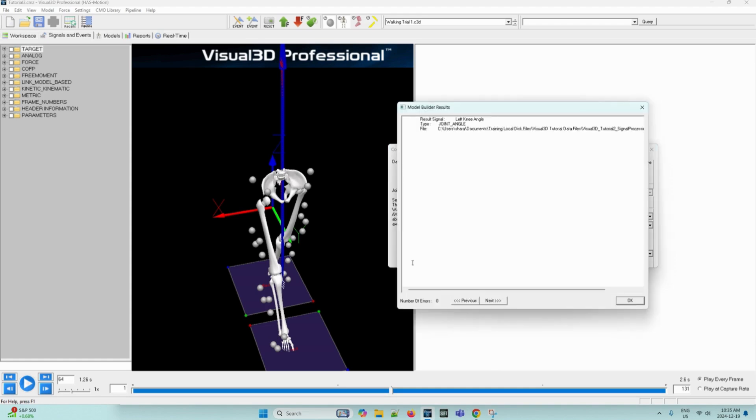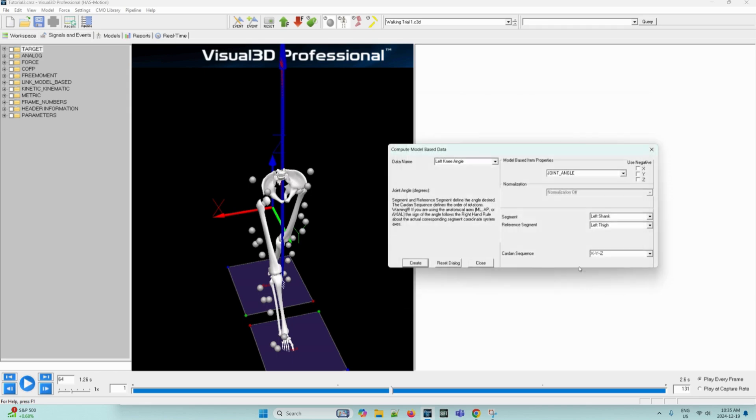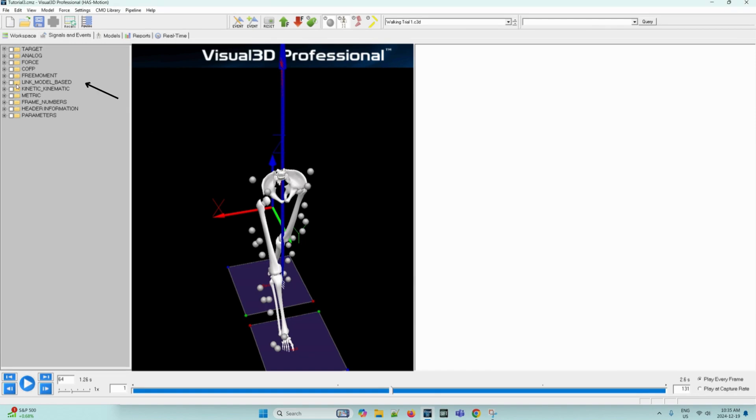After completing these steps, we can close these dialog boxes. And then we can look at the data tree. If we open the link model based folder, which was newly created, and then if we open the original sub folder, we can see that our left and right knee angles are present in here.